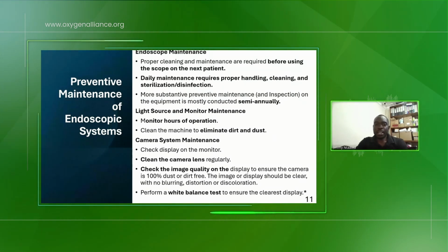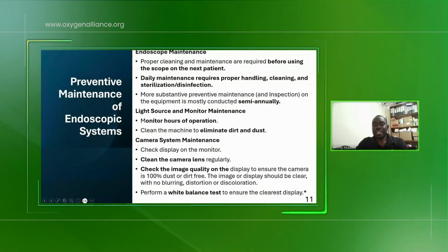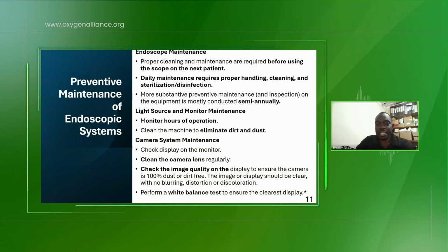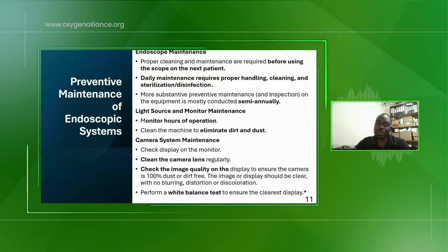So here we shall focus more on proper handling, cleaning and sterilization. And we'll go ahead and say that we rarely maintain the scopes, but when we do, we can do it semi-annually. And this requires qualified personnel to do it. It's not everyone that is supposed to handle scopes.